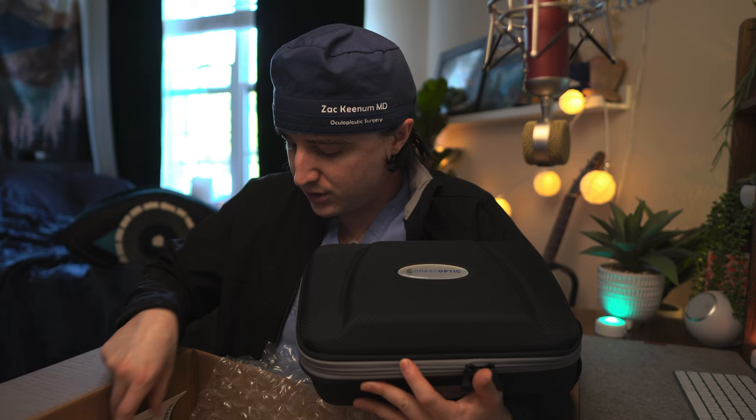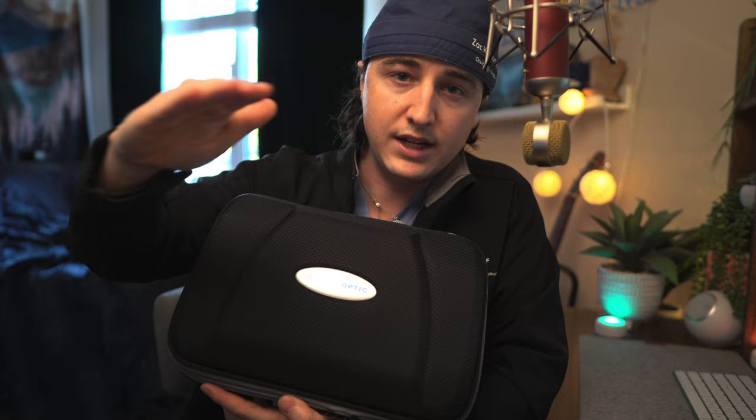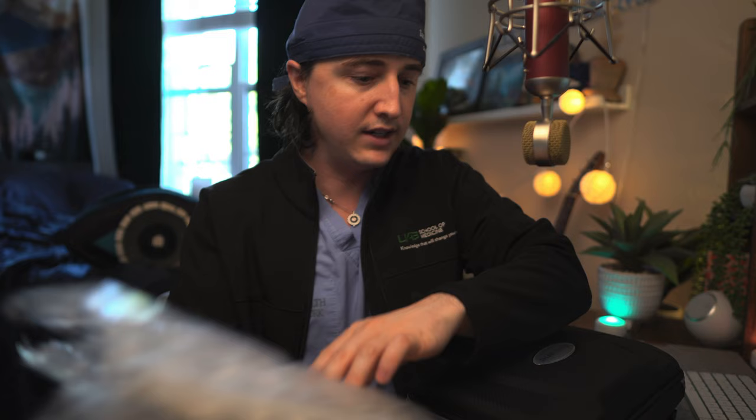Then I reached out to Oroscoptic, met with their rep, and I liked their loops really well and their frames really well — best of both worlds. For a lot of people frames may not be so important, but I like the aesthetic of the loops. I also rank their customer service number one, Surgitel number two, and Designs for Vision had the most difficult time setting up meetings. That's why I went with Oroscoptic.